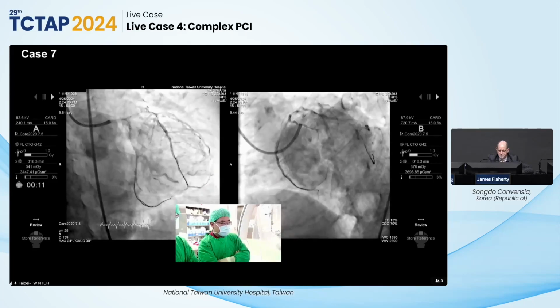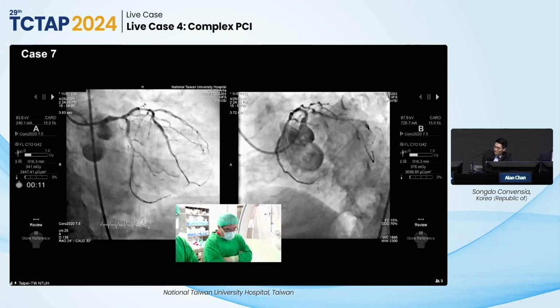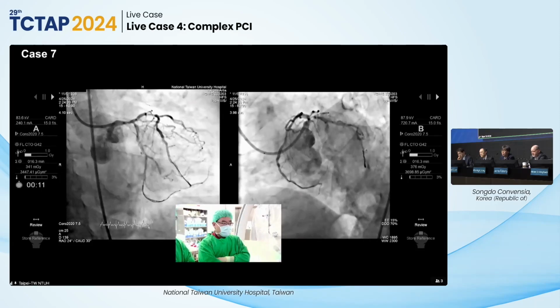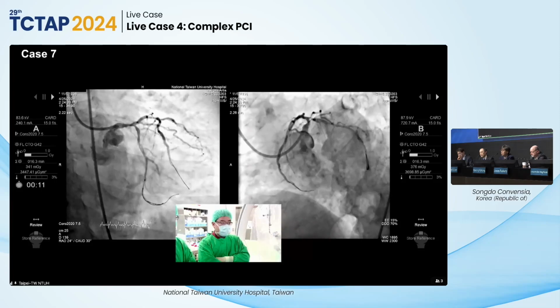Understood, yes. Dr. Kao, if that's the case, maybe we need to expand the lumen a bit. But the left main to LAD angulation is relatively straight. Yeah, it's so short, my impression is that probably we can send the IVL balloon in.